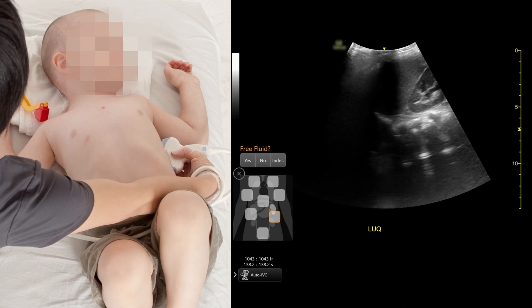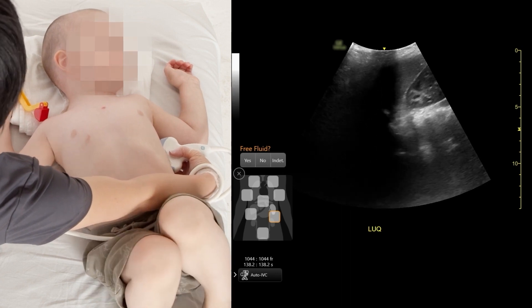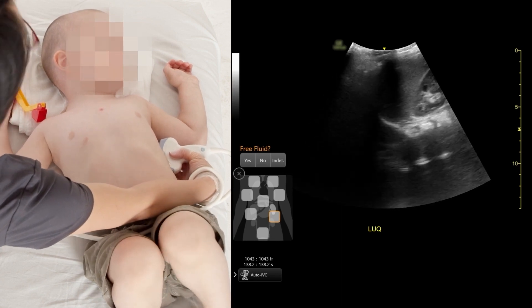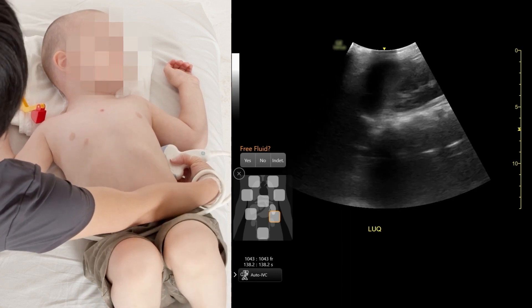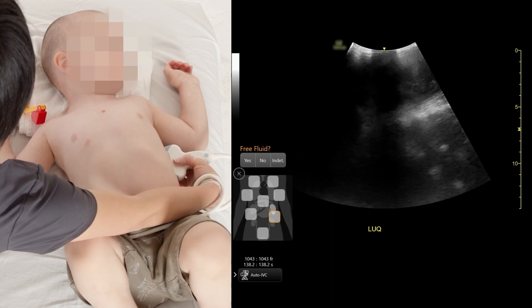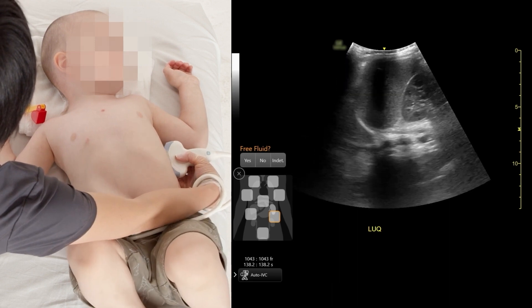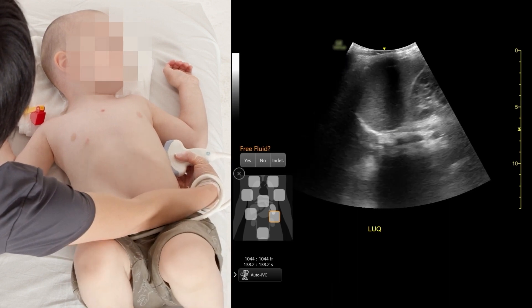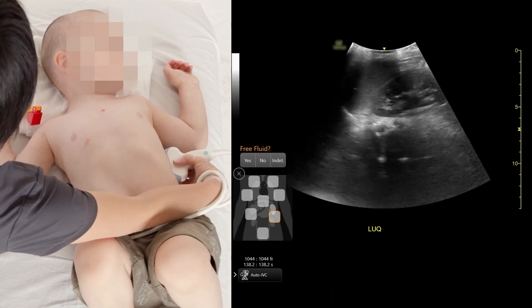Same as the other side — you want to look around above the diaphragm, around the kidney inferiorly and posteriorly. Make sure that you look for fluid everywhere.